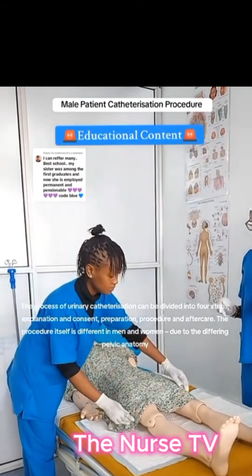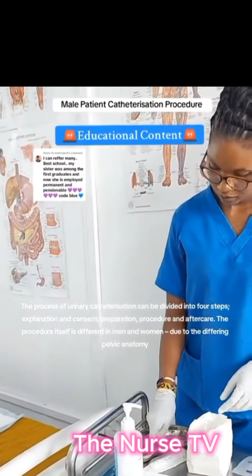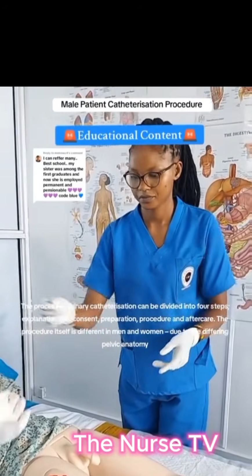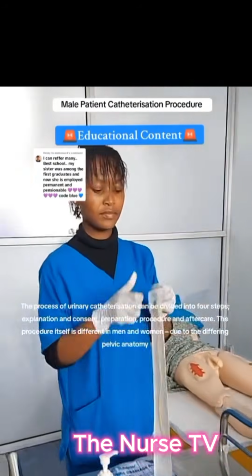The process of urinary catheterization can be divided into 4 steps: explanation and consent, preparation, procedure, and aftercare. The procedure itself is different in men and women due to the differing pelvic anatomy.